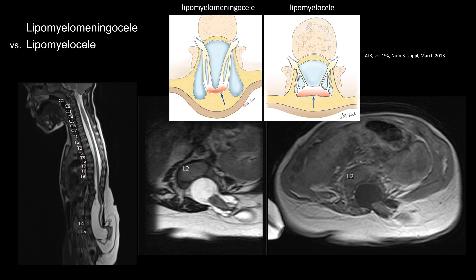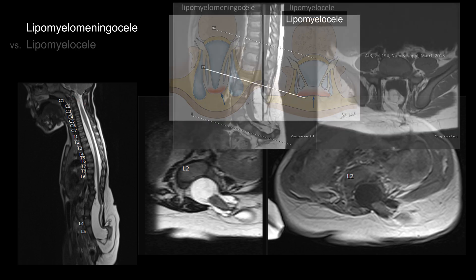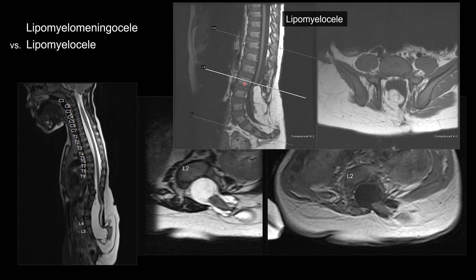Those are the open dysraphisms, again associated with Chiari II malformation. This is an example of a lipomyelocele. Notice that the lipoma and the neural placode interface is inside the canal, unlike lipomyelomeningocele where the interface is outside the spinal canal.